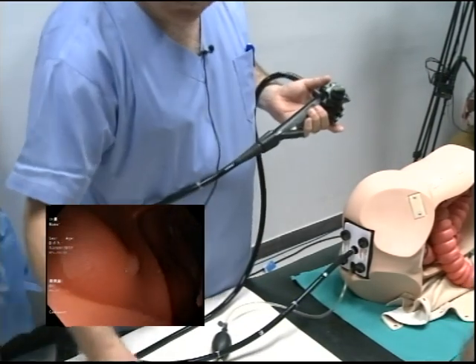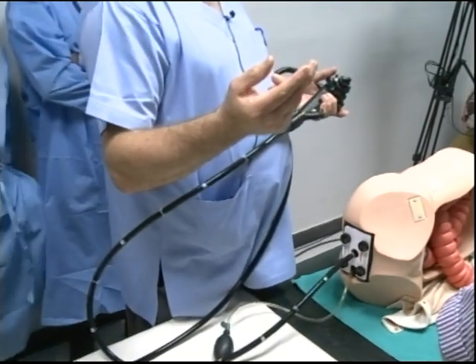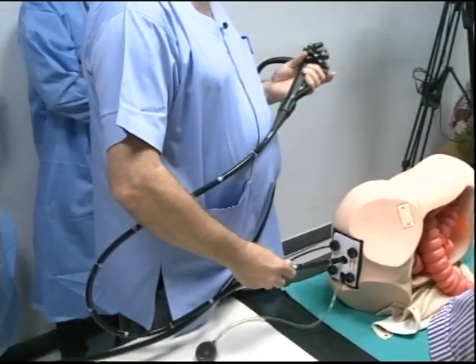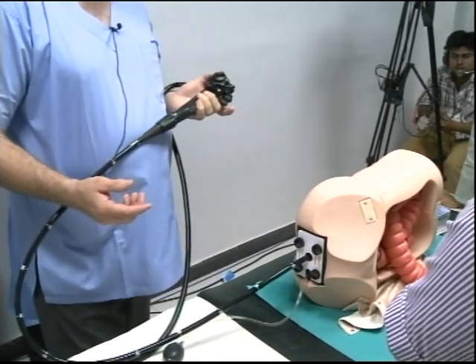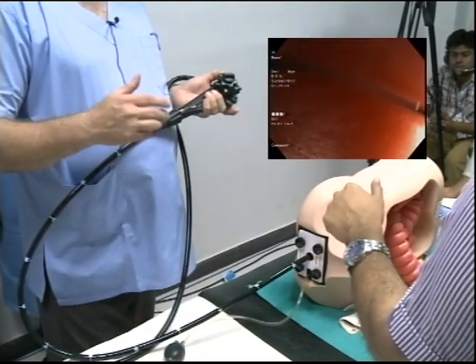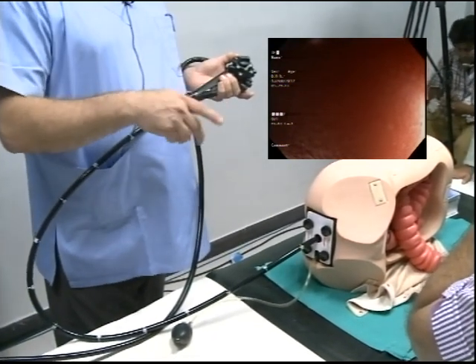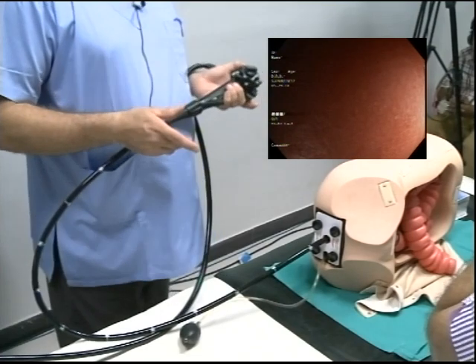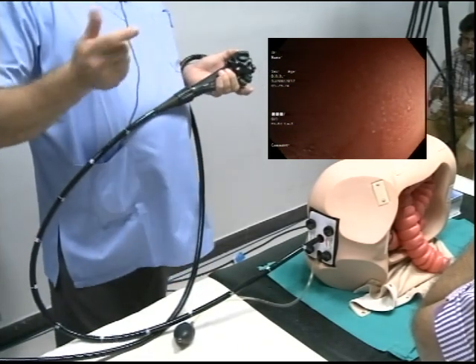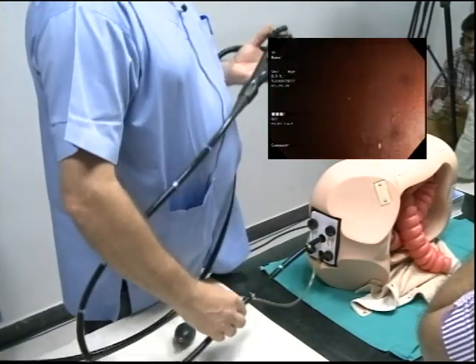So why do you guys get a glove and use one of these? When I've just shown you that I've got lubricant all over my fingers and I can apply torque steering. Why? Okay, why does your boss then use the cloth? Because your boss will tell you he wants to grip the scope, it gives him a better grip. But I've just shown you, I've got rubbish on my fingers, that you can actually still have a good grip on the scope.